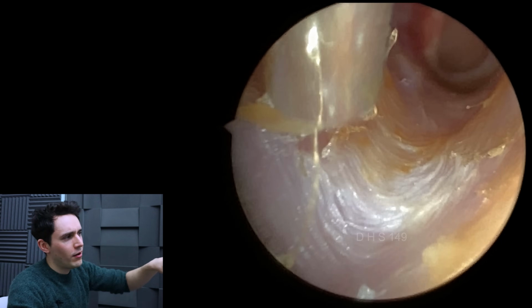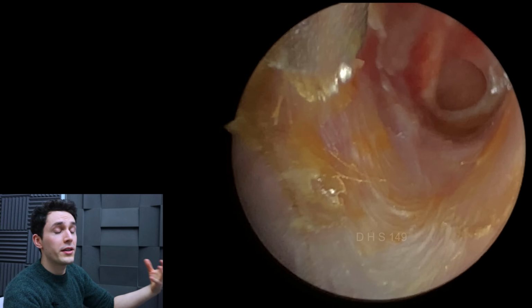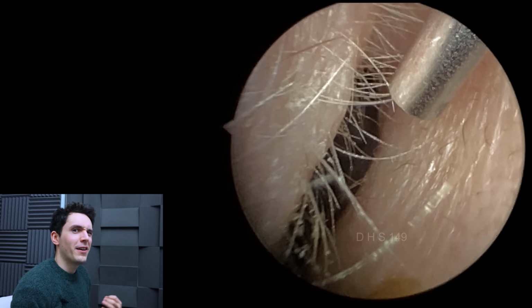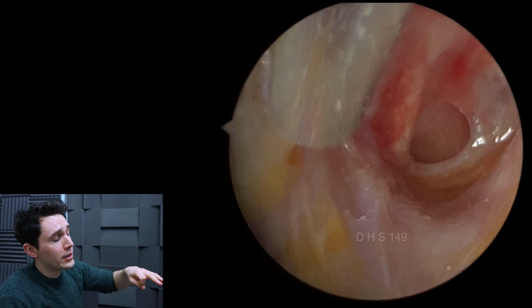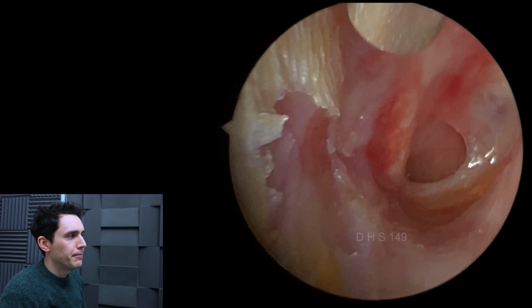And this client is a hearing aid client of mine, and I've been keeping a close eye on him. Working with his general practitioner doctor, we've been able to keep his ear relatively infection-free, other than fungal growth here and there now and again. But otherwise, he's had quite a good outcome. So this is the worst that I've seen his ear.